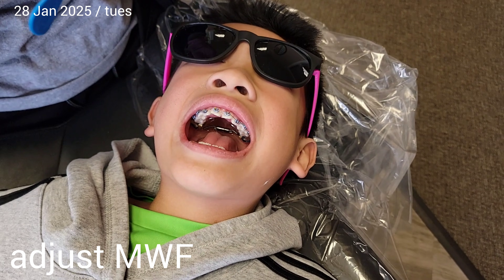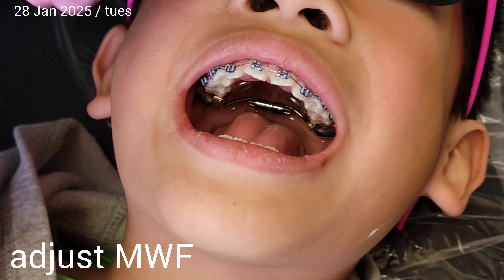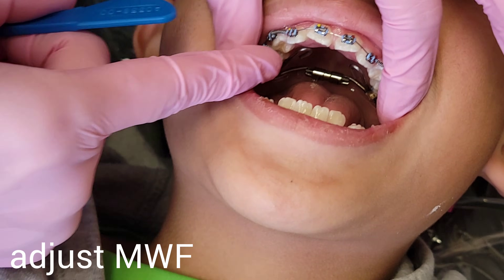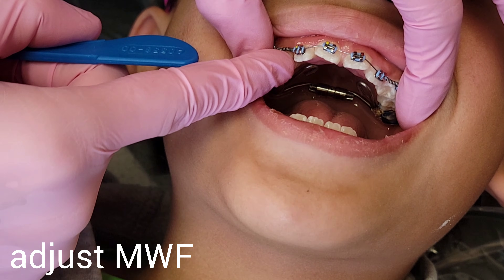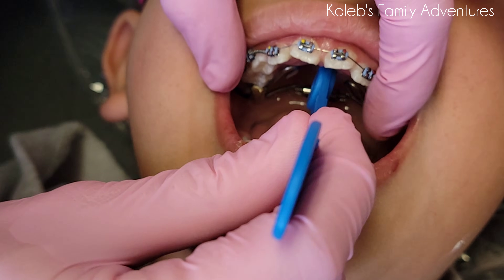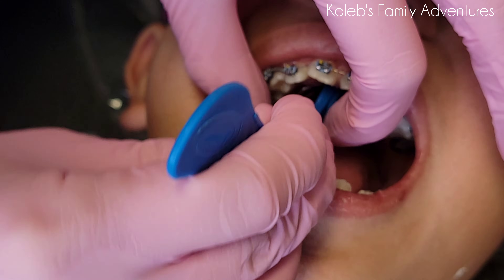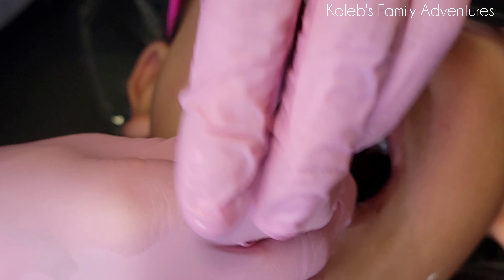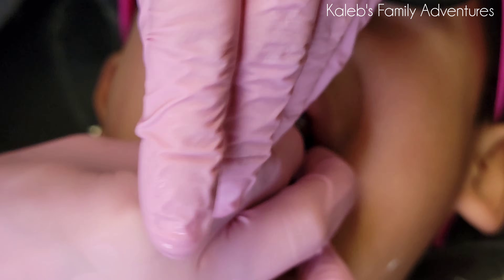Do this at night, lay him down in his bed or something like that. You can do this two ways, but do you see that hole directly in the middle? We're gonna put this in there and it's gonna kind of sink in a little bit like that — we're gonna push this down.